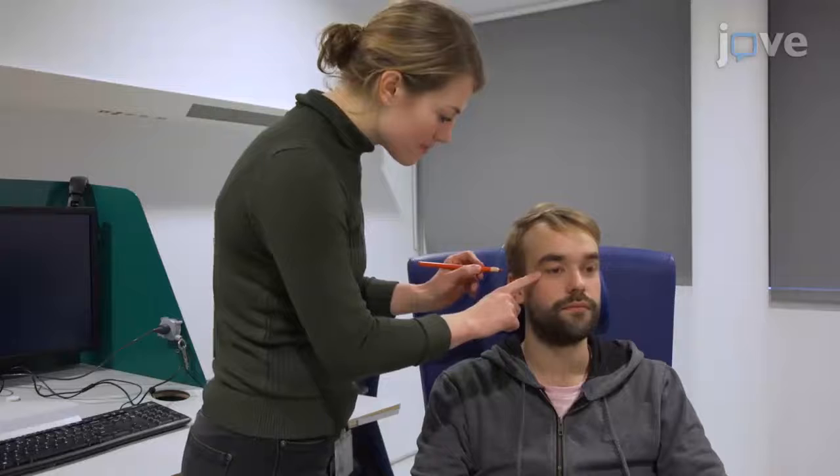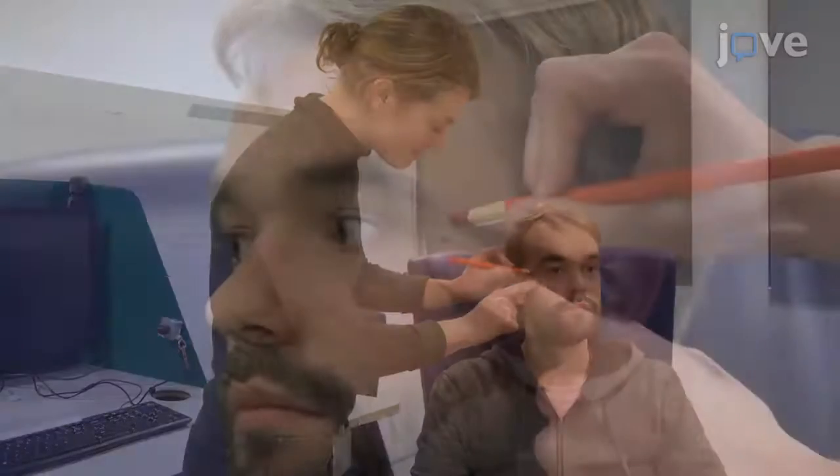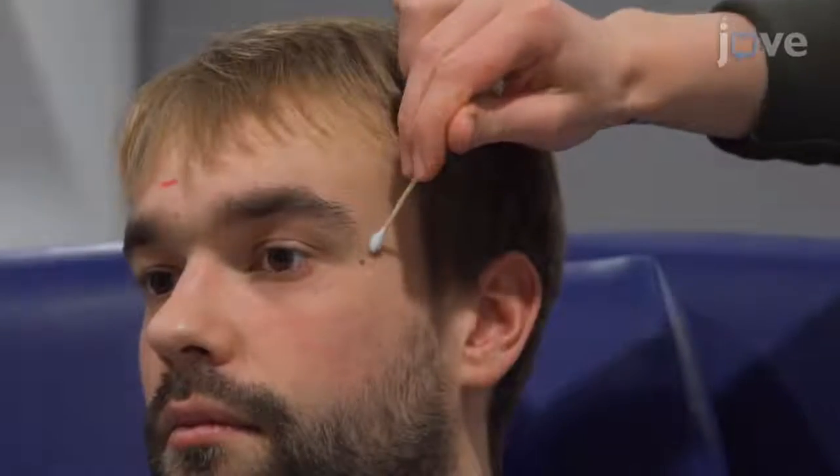In this step, identify the outer canthus of the right eye. Repeat this procedure for the left eye. Then, identify the place for the ground electrode 2 centimeters above the nasion. Thoroughly rub the sites of the eye electrodes using a cotton wipe.